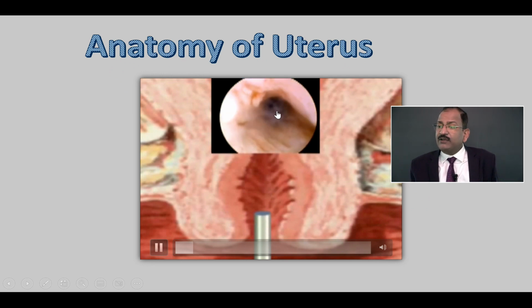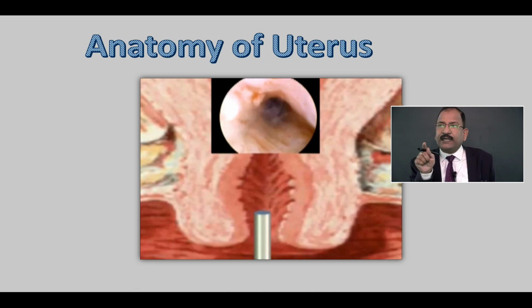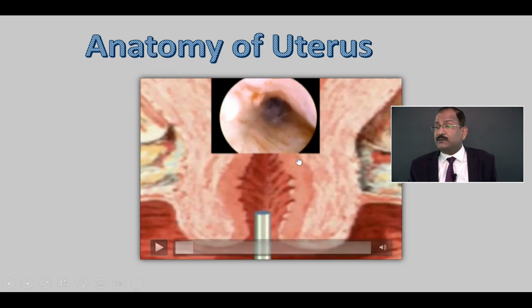Because with 0 degree you can see all the surrounding wall together with the black hole in the center. 30 degree always sees on the side. Because 30 degree is like a squint. Squint people are talking to someone and looking at you, and you don't have any idea to whom they are talking. In the same way, 30 degree will see like that and enter in front. So it's bad actually, and then slowly you will enter.